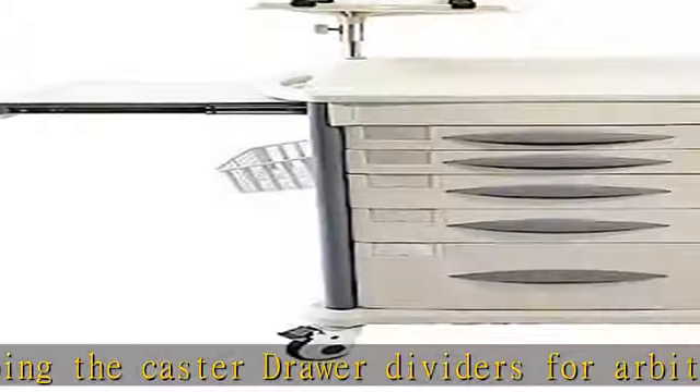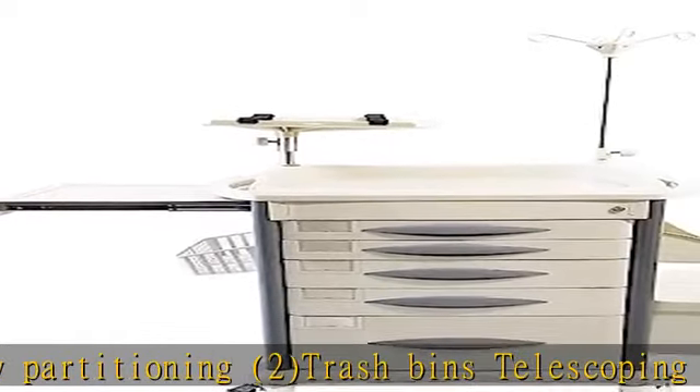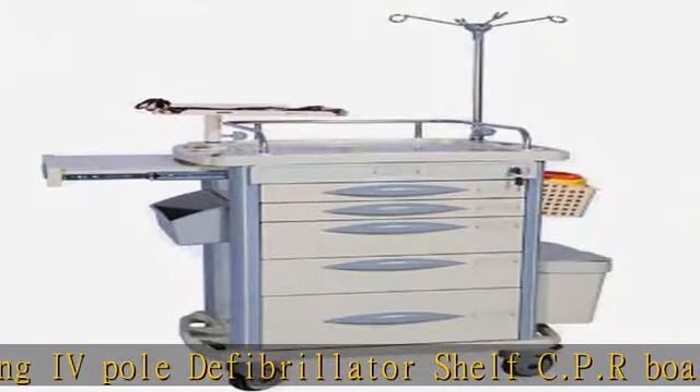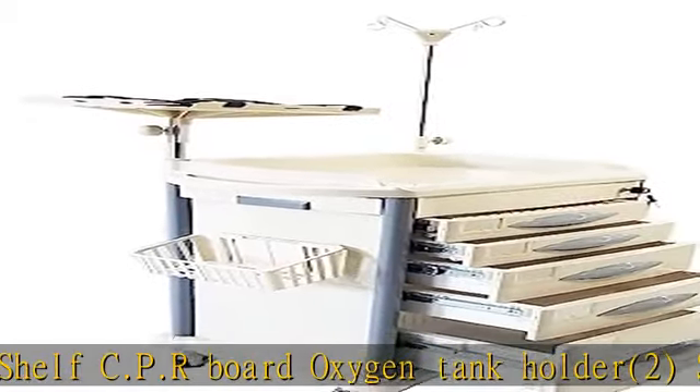1 large drawer: 16.5 in W x 14 in D x 8 in H. Overall dimensions: 19 in D x 30 in W x 38 in H. Made of ABS plastic with a lin-1 tabletop with raised sides to eliminate items from falling off.